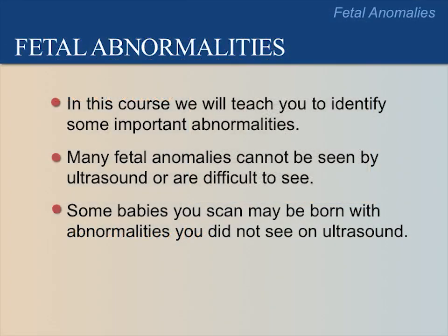In this course, we will teach you how to identify some important abnormalities. Many abnormalities cannot be seen by ultrasound or are difficult to see. Therefore, we do not expect you to identify all abnormalities on ultrasound. Some babies you scan may be born with abnormalities that you did not see on ultrasound. This does not mean you made a mistake.